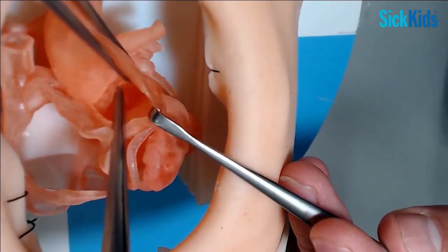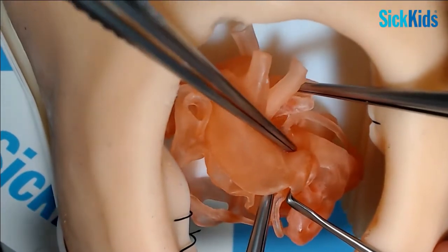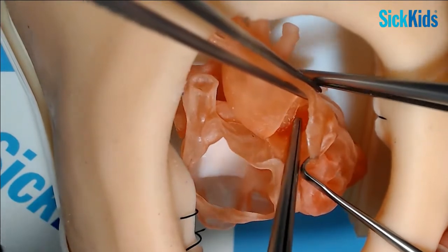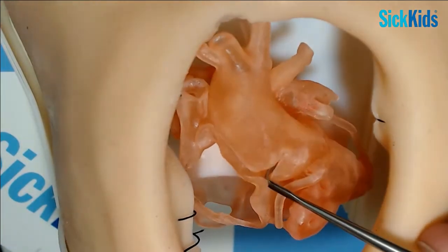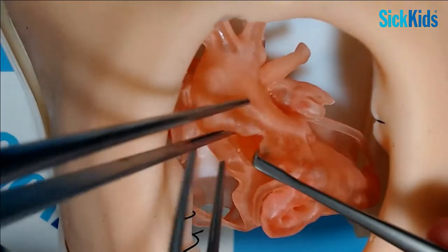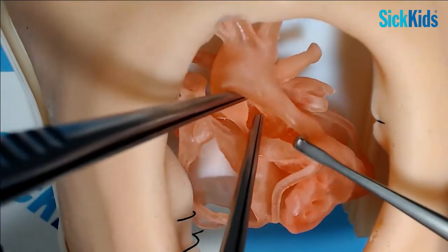So the other coronary is at the back here, but I don't think you've got an ostium, have you, Nabil? I'm kind of poking my forceps in there, but it's at the back. There's not really a true ostium on this model, but you have to really check because you can really get yourself in trouble if you don't look where they are. So we've opened up the trunk, we're looking inside, and we're looking for the origins of the PAs.